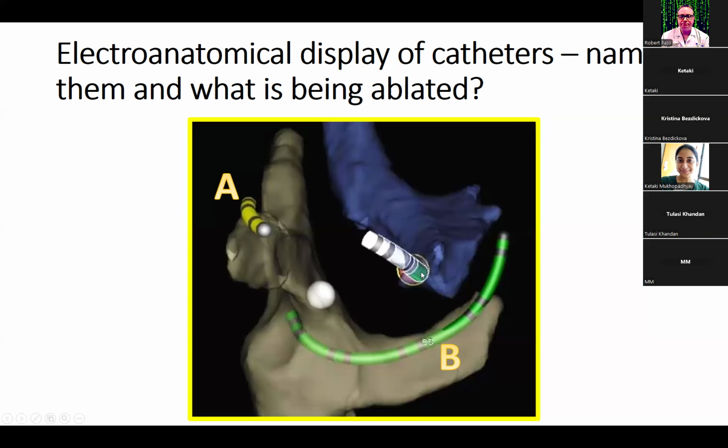Where do you think this ablation is occurring, Molly? It looks like your ablation catheter is following the direction of the coronary sinus catheter, and more like you meant, in terms of anterior-posterior, going posterior. So I'd say it's a left-sided pathway, probably more towards lateral, or a left, more posterior pathway. Yeah, this is a left-sided pathway.